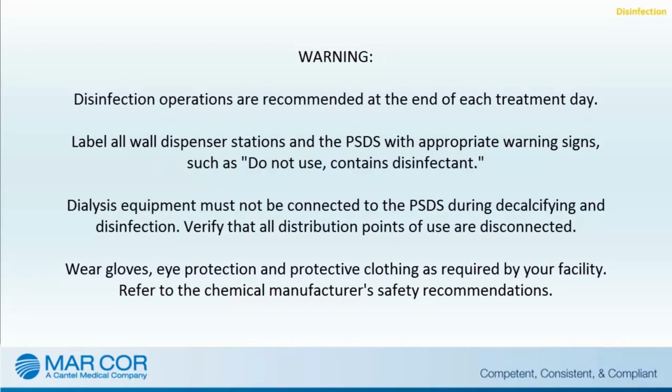Warning: disinfection operations are recommended at the end of each treatment day. Label all wall dispenser stations and the PSDS with appropriate warning signs such as "Do not use, contains disinfectant." Dialysis equipment must not be connected to the PSDS during decalcifying and disinfection. Verify that all distribution points of use are disconnected. Wear gloves, eye protection, and protective clothing as required by your facility. Refer to the chemical manufacturer's safety recommendations.